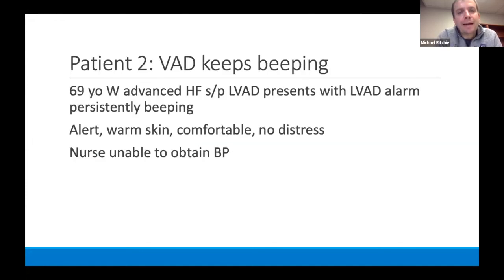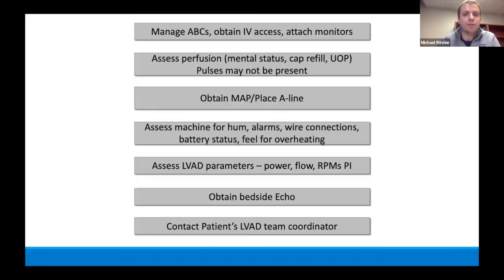Patient 2 came in, their VAD keeps beeping. They look very comfortable, but the nurse is unable to obtain a blood pressure. So you bring them in. Again, you're going to go down your differential. She seems to be perfusing, but you want to obtain a MAP.